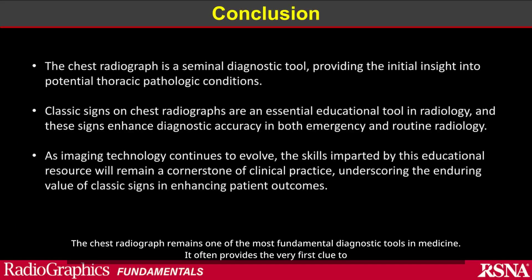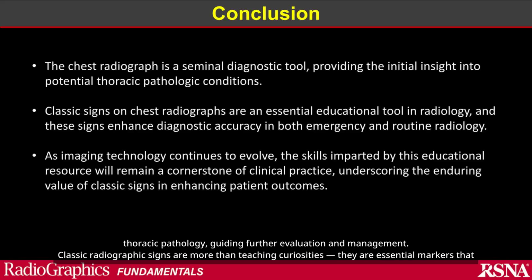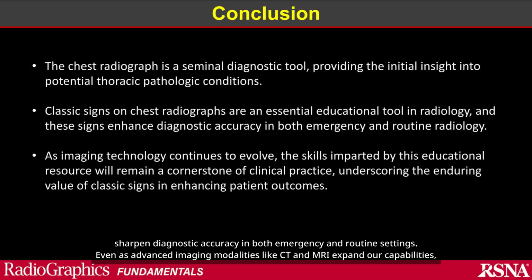The chest radiograph remains one of the most fundamental diagnostic tools in medicine. It often provides the very first clue to thoracic pathology, guiding further evaluation and management. Classic radiographic signs are more than teaching curiosities. They are essential markers that sharpen diagnostic accuracy in both emergency and routine settings.